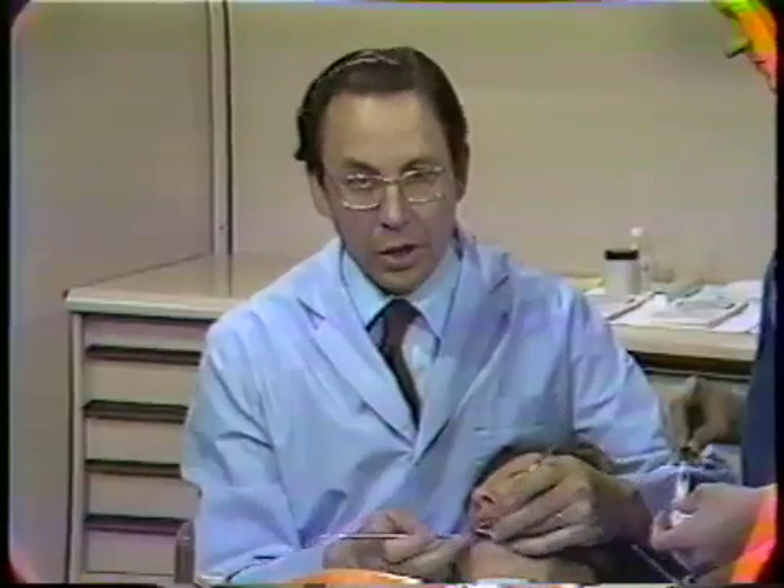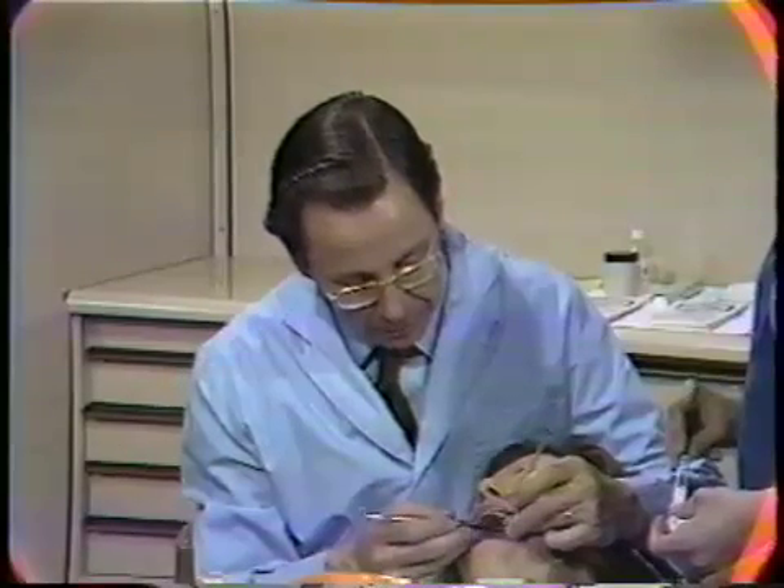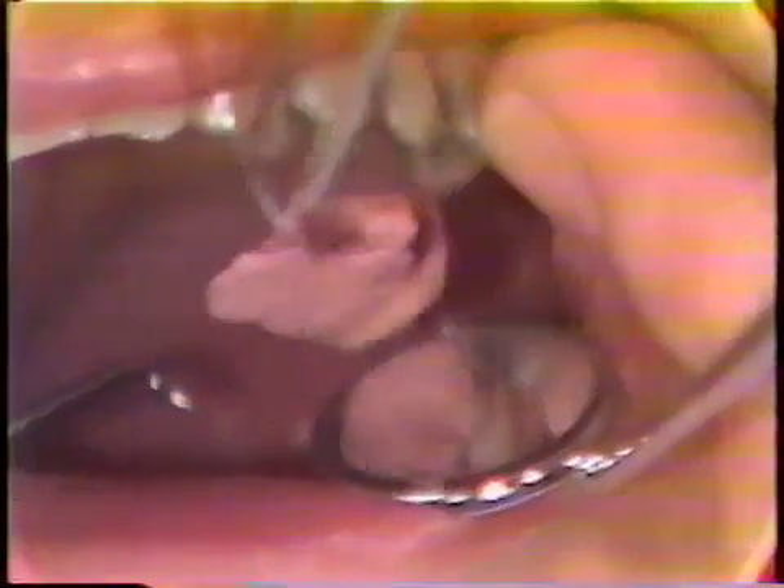The removal of the dressing on the lingual side is very similar to the buccal surface. The rigid end of the scaler is placed underneath the margin of the dressing, and it is teased very slowly away from the surgerized area, the teeth, and slightly occlusally. It appears that this lingual dressing is going to come out like the buccal did — very easily, all in one piece. The assistant will remove the dressing the rest of the way.